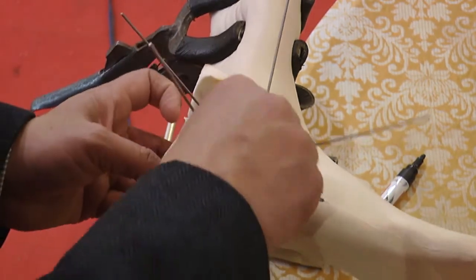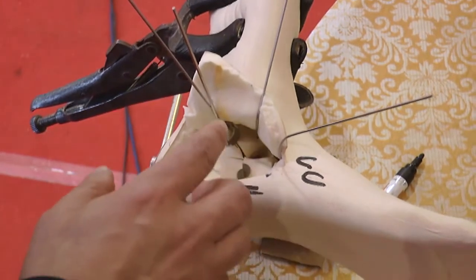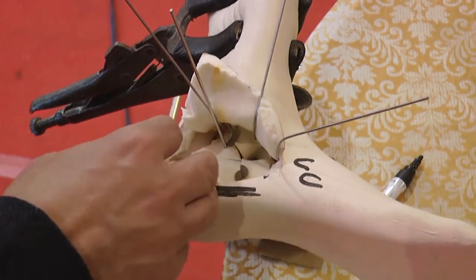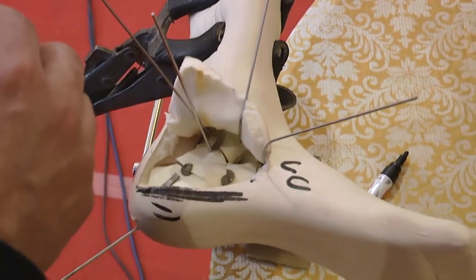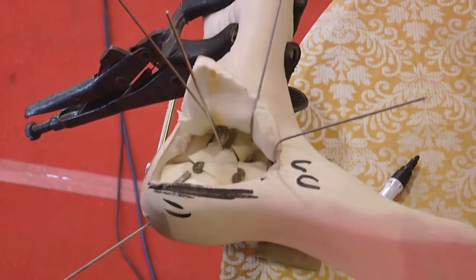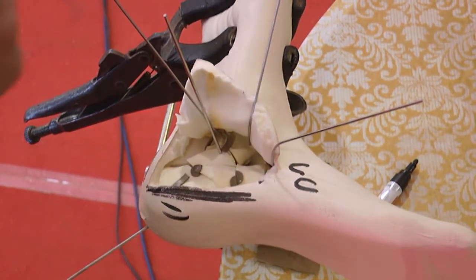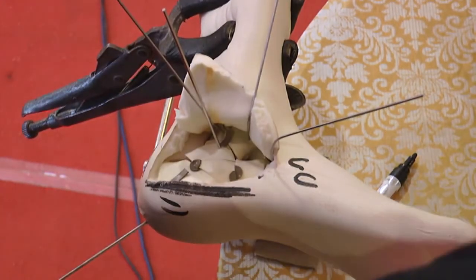So that is the lateral wall blowout, which has been now put back. You can actually crush the lateral wall blowout and put it in the void which has been left by lifting off of the lateral facet. So there's a big void. It does not require a bone grafting, but I prefer to crush the lateral wall and put it in the void. And the next step is simple, to put the plate.